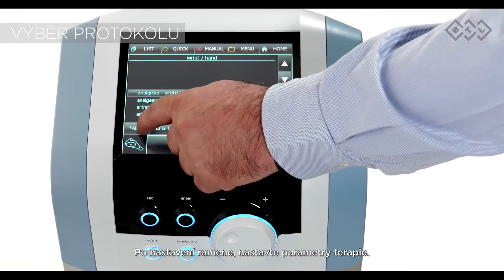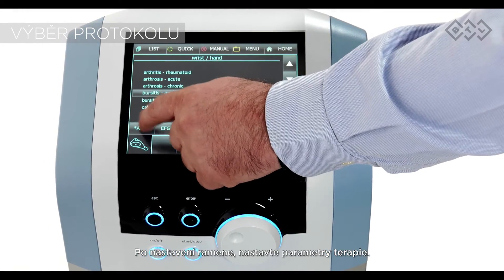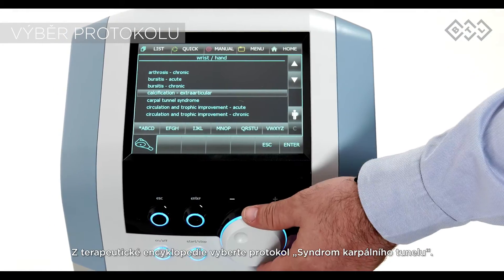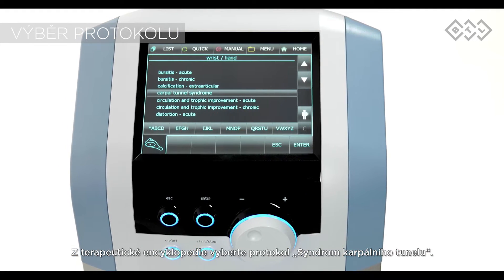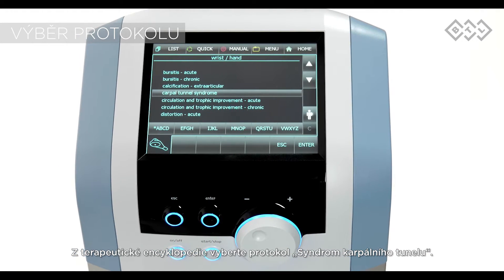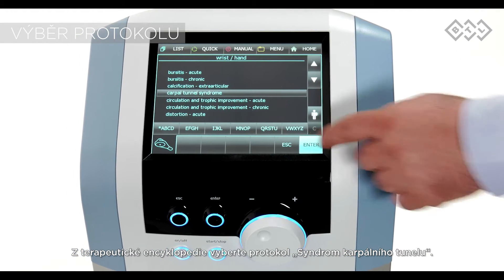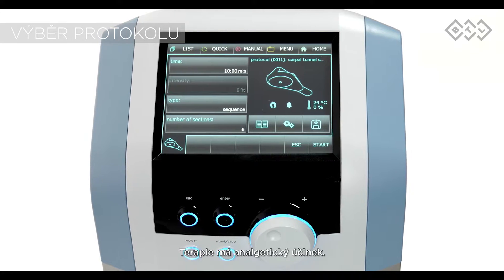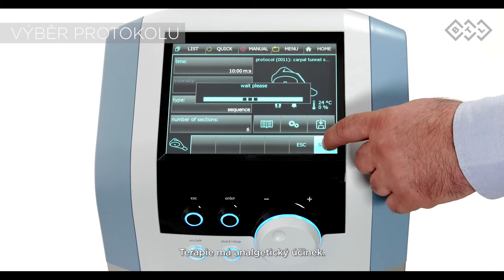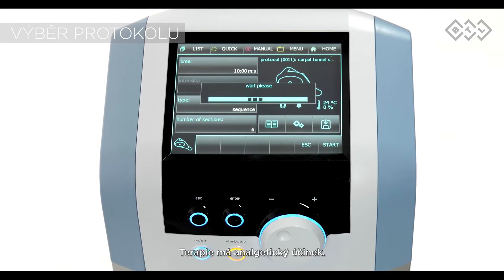After locking the arm, set the parameters. Select the carpal tunnel syndrome preset protocol from the device encyclopedia. This protocol suppresses pain in the area.